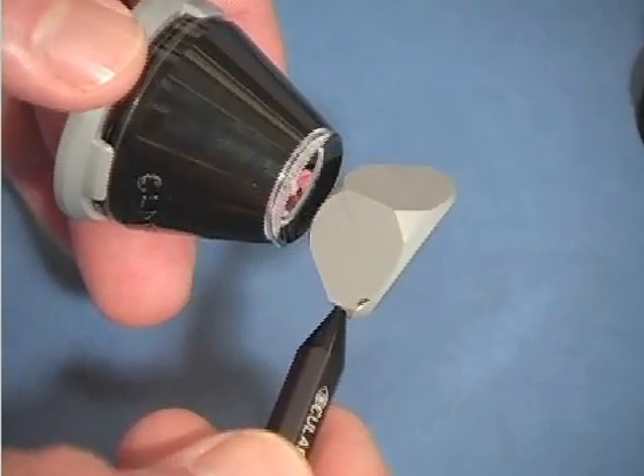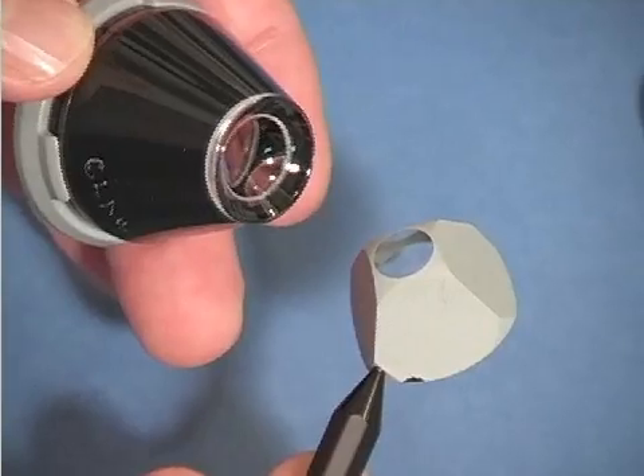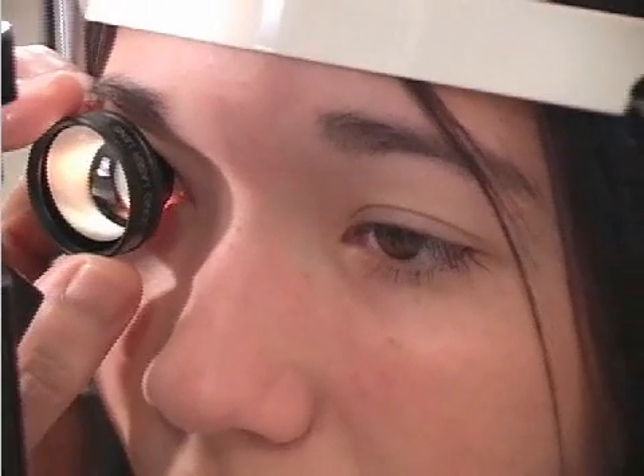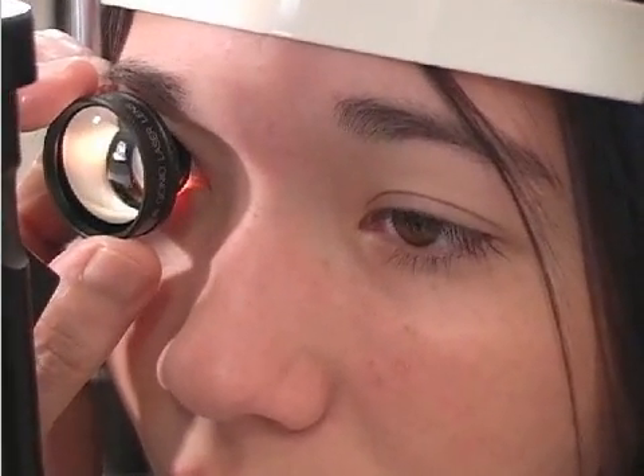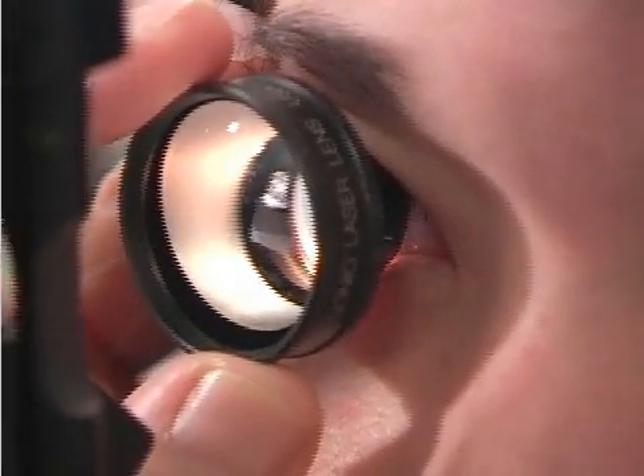They are excellent lenses to be used for surgical procedures in the angle, such as trabeculoplasty. Many of the clips — in fact most of the clips on this webpage — are photographed through the MagnaVue lens, which is a one-mirror variation of the Goldman lens.